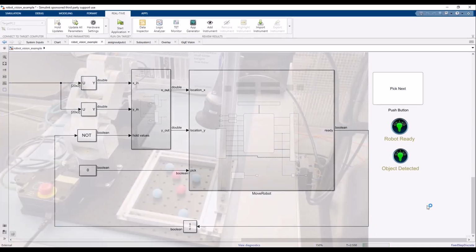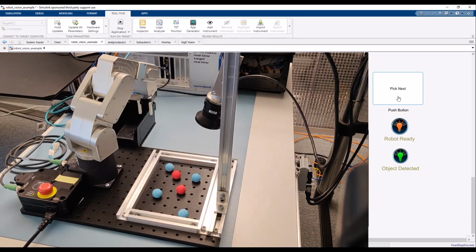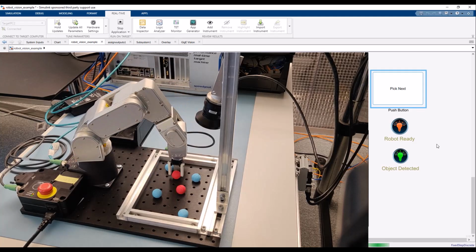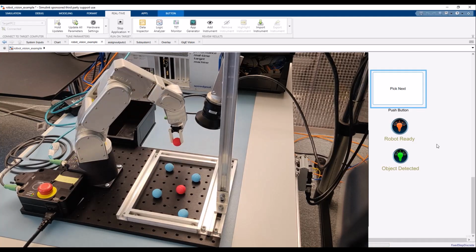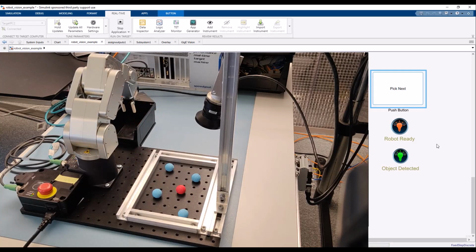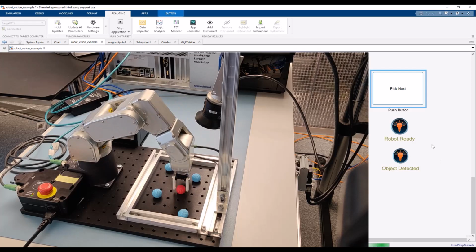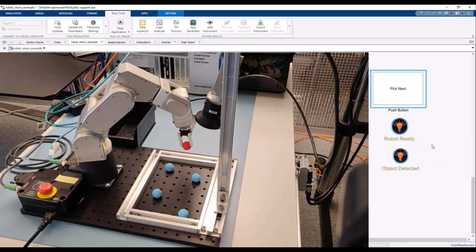You can see the robot on the camera here, and the dashboard shows that it is initialized and the objects have been detected. So when I click the Pick Next button, the robot will move the first object from the list and remove it. I simply click the button again while the objects are being detected, and of course this can be fully automated later, but for testing purposes it is handy to have these controls.